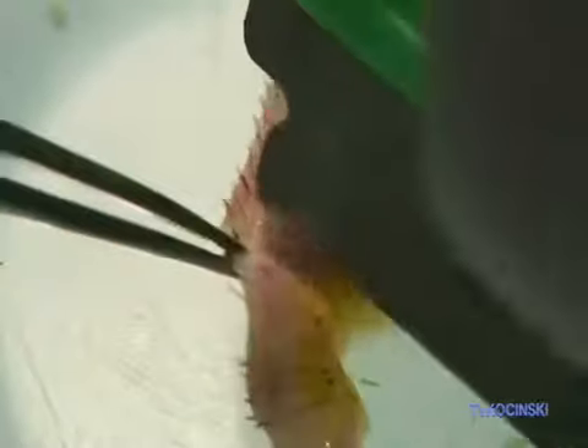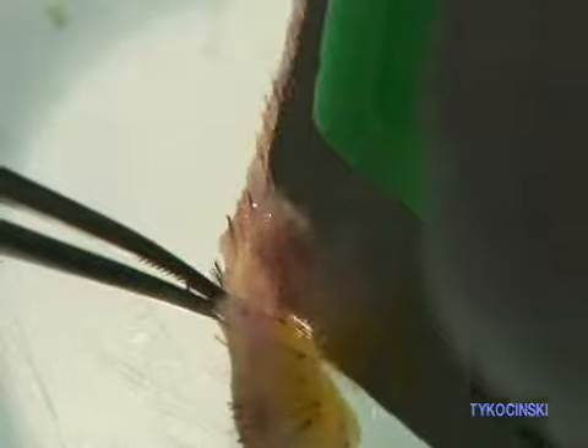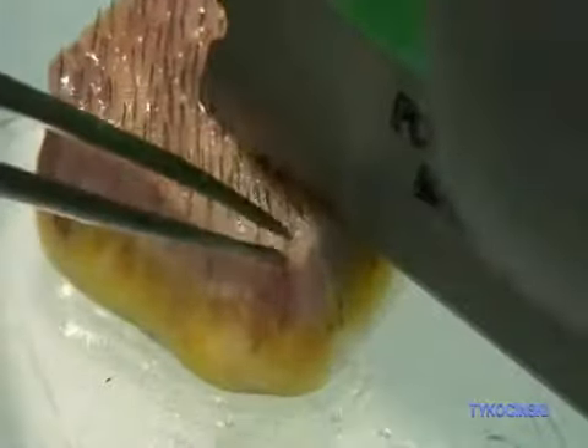We are decreasing density, like here. We can see 2 follicular units close together — in fact, there's a follicular grouping. If we split them, instead of a follicular grouping, we're going to have 2 follicular units, and we don't want that.